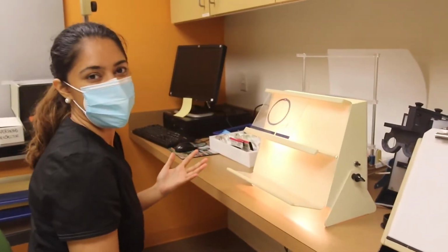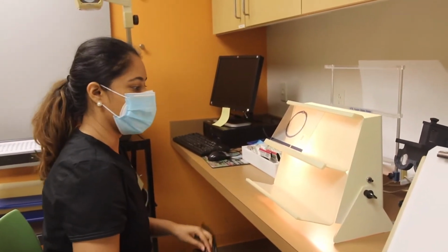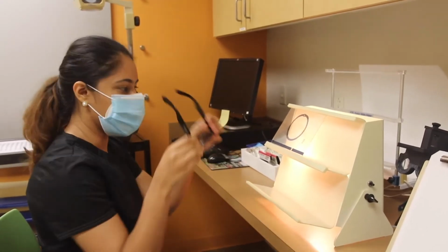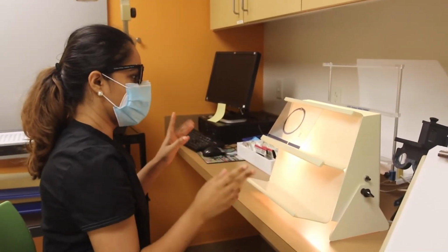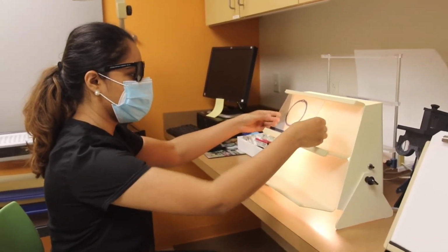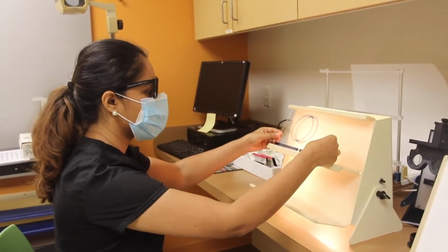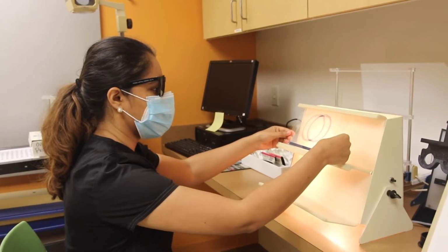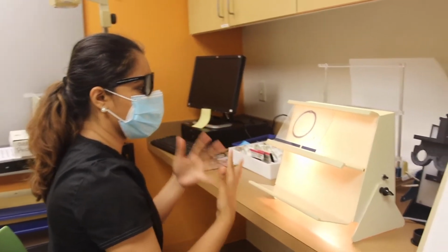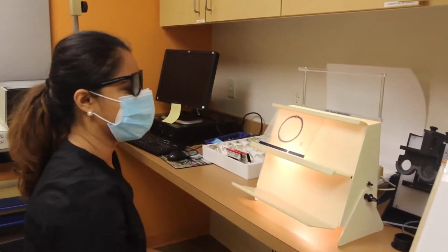So another activity we use very commonly is called vectograms, where we're also checking if both our eyes are working together. You put these really cool 3D glasses on and look at the vectograms, and you practice your eyes crossing and relaxing. We make sure that all patients are able to do this activity, again making sure their eyes are able to focus, work together, and complete these activities. And they also look cool doing it.